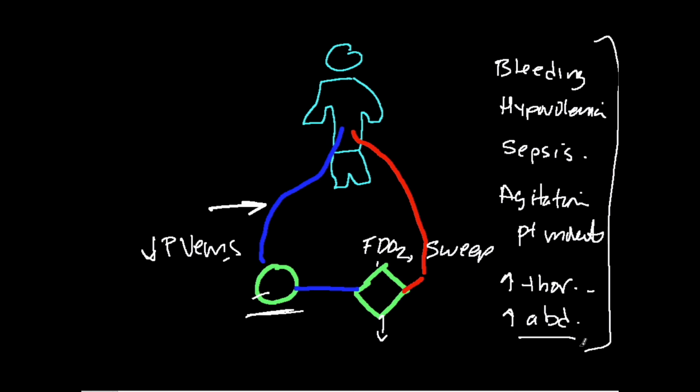The right spot is in the intrahepatic IVC, and the liver kind of stents it open. It's more of a pipeline-like vessel than something that's collapsible, which is ideal for a cannula position. So migration either too far or too shallow from that position can cause problems with venous drainage, and that's something you have to look at.